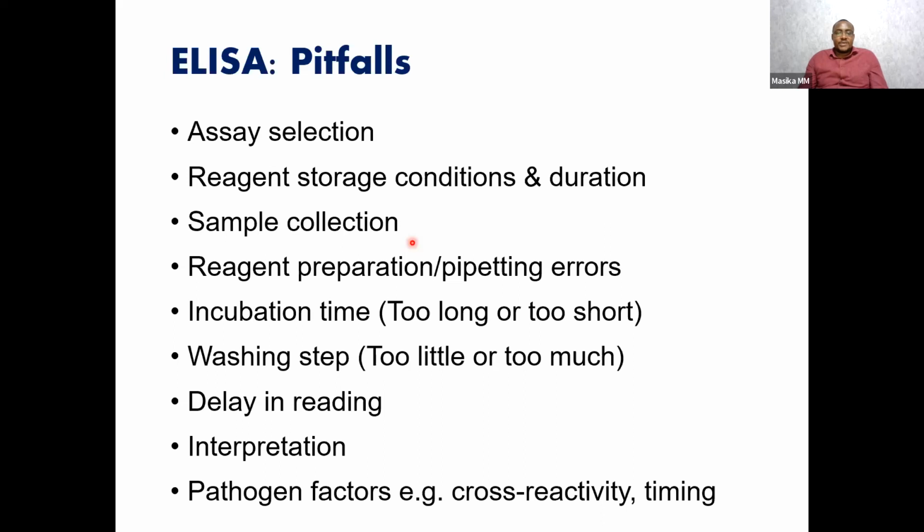Then there are reagent preparation and pipetting errors. So maybe you are told to add 10 microliters of the antibody, but you add 100, or double. What happens is that there may be non-specific binding, which also gives you the wrong results.